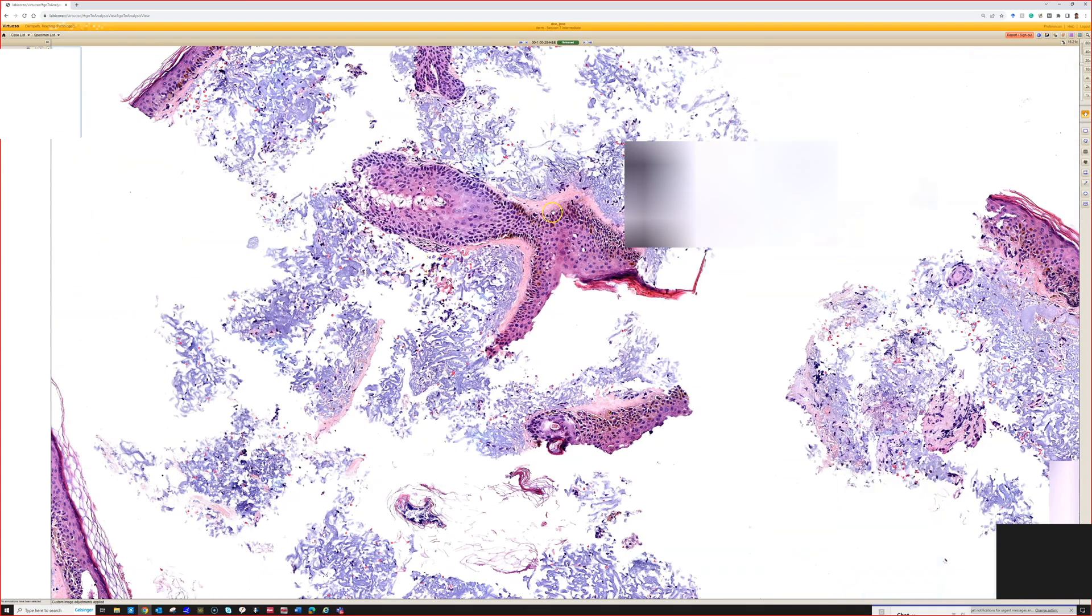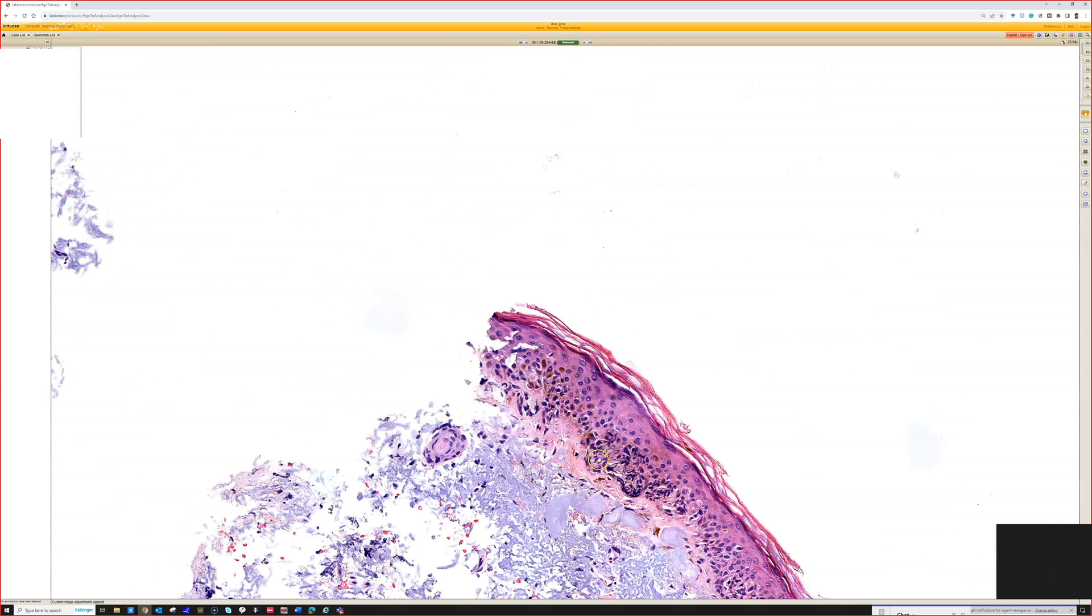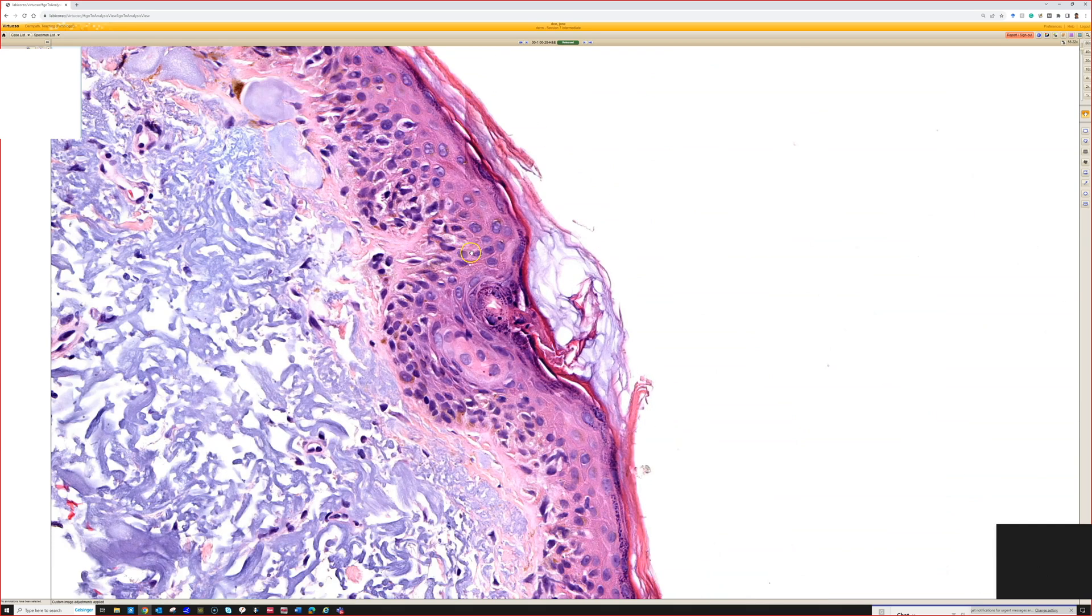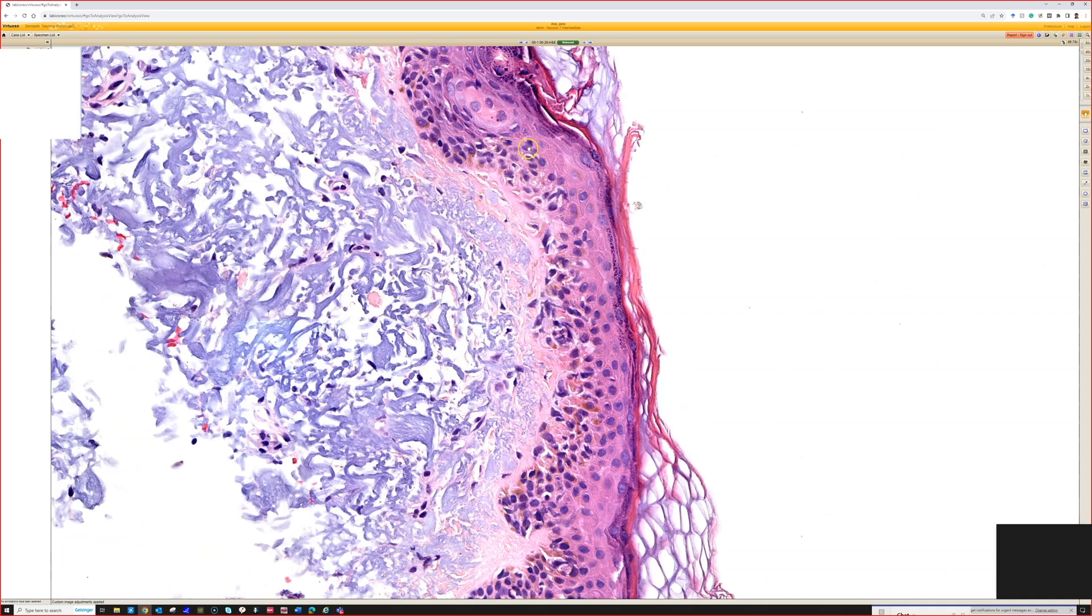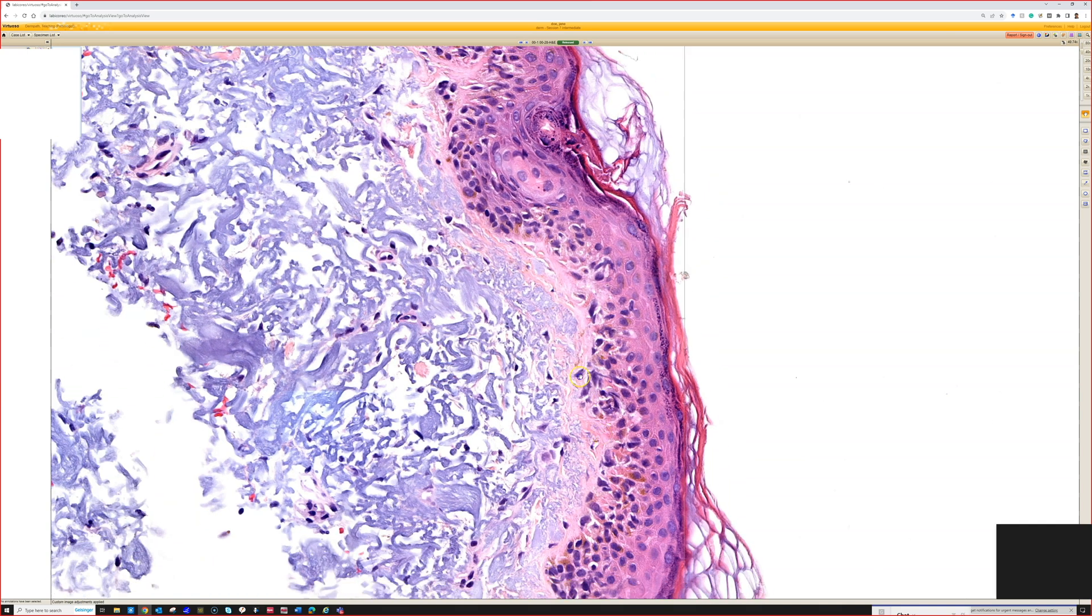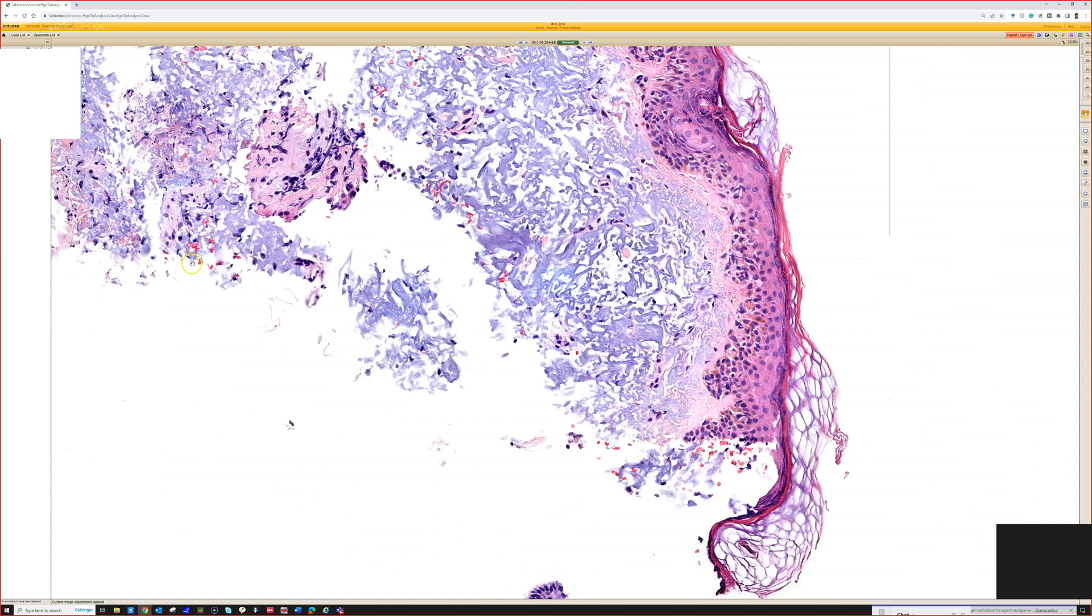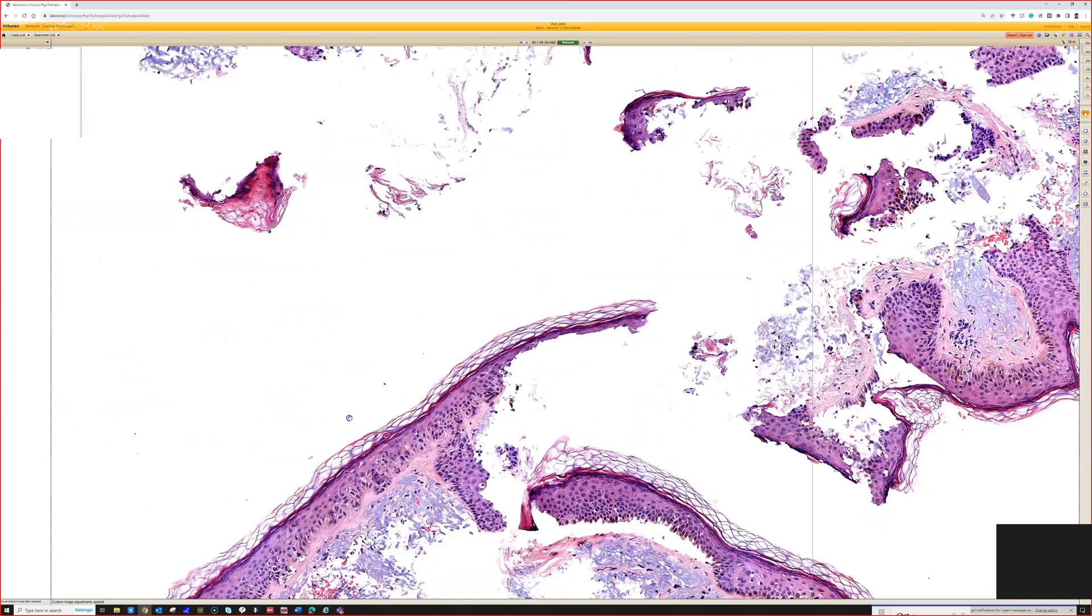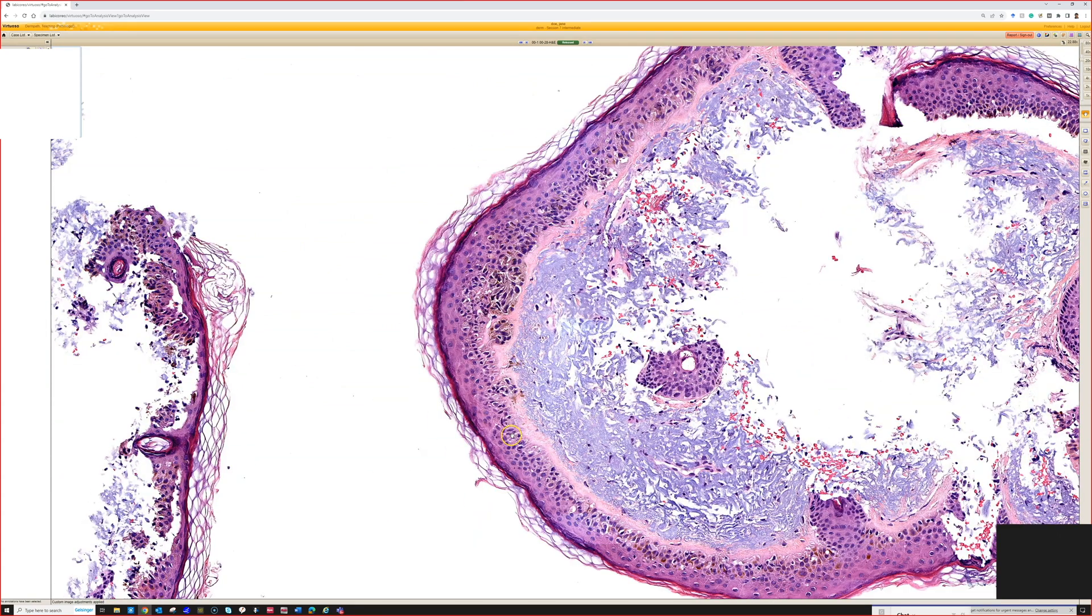And then in other areas you can see nesting. There's nests right here, obvious atypia here. If you're just starting out, sometimes it can be hard to tell, are these melanocytes or keratinocytes? The pale cytoplasm I think is really helpful. The pigmented cells here are actually mostly keratinocytes. I've got a video about melanocytes versus keratinocytes that has some tricks. That's a short video you might find helpful. You can go check that out on my Kiko index with the link down below.